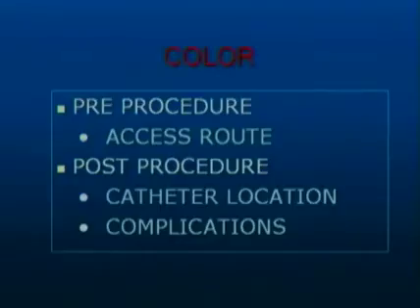Well, in summary here, I would say probably one of the most important things for you to do is to do color flow pre and post. You can do it pre to note the route you're going to take, and you can do post for potential complications. Again, I would emphasize with ultrasound, think about that coaxial technique for needle placement. In case you do get into complications, that will be helpful. Thank you very much.